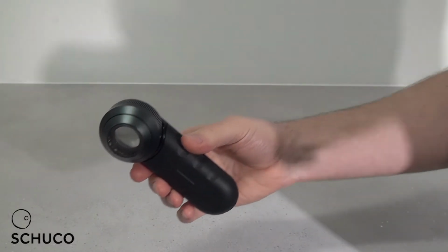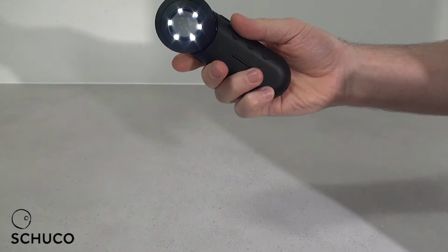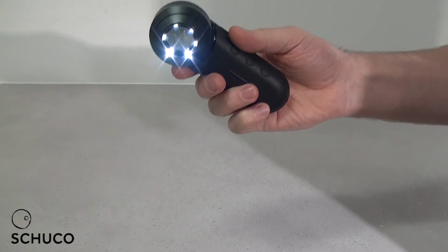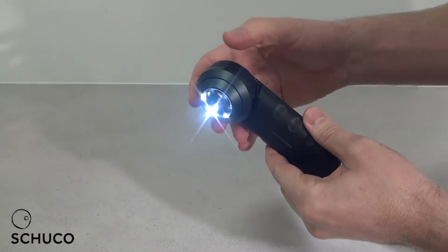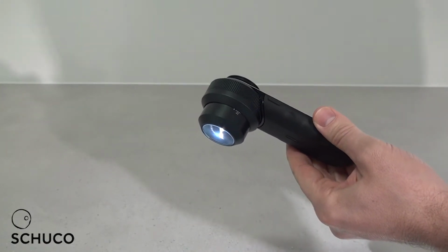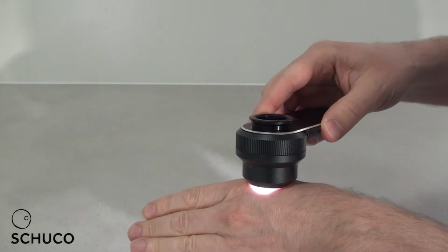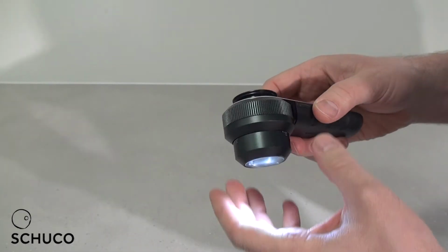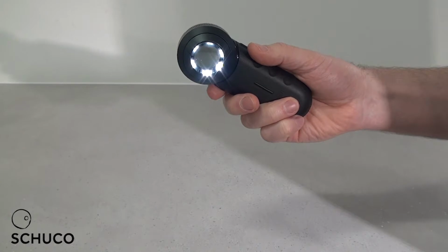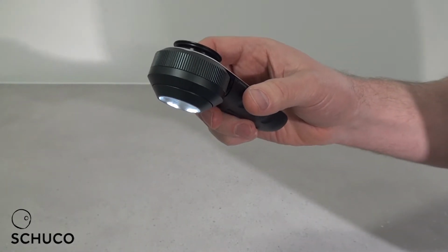I'll now talk to you about the 2 different types of dermoscopy. There's the polarizing setting and one click to the non-polarizing setting. For the teledermatology project, we want you to use the non-polarizing setting. Now this needs contact with the skin. So what you need to do is open up, by rotating the dermatoscope, the focus dial till you get to the 0. The 0 is the perfect setting for the camera. And this needs direct contact with the skin in order to take an image. The polarizing setting does not need contact with the skin, and you can actually use it to scan or screen moles, and you get a slightly different image compared to the non-polarizing image.